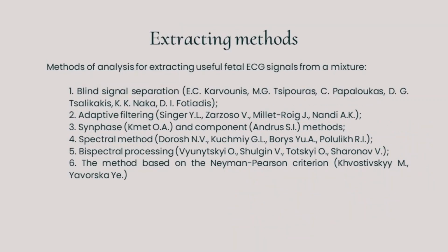Existing methods for extracting useful fetal ECG signal, such as blind signal separation, synphase and component methods, spectral method, bispectral processing, the method based on Neyman-Pearson criteria, have limitations as they do not consider time-frequency characteristics and phase-time parameters simultaneously. Therefore, a new algorithm is proposed to address these issues and provide more reliable results.